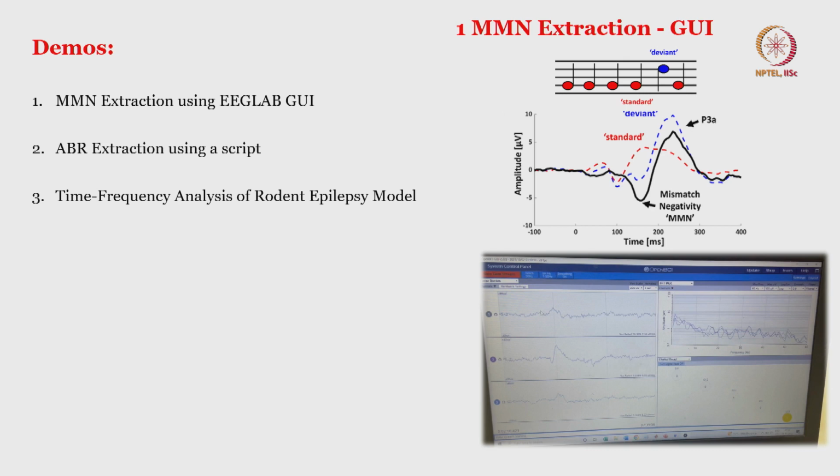However, research is going on to minimize the number of iterations, called the number of epochs, in ERP or event related potential research. I will come to that. Basically, very briefly, in simplistic terms, two different kinds of sound are presented to a subject, and EEG is recorded in response to that sound.